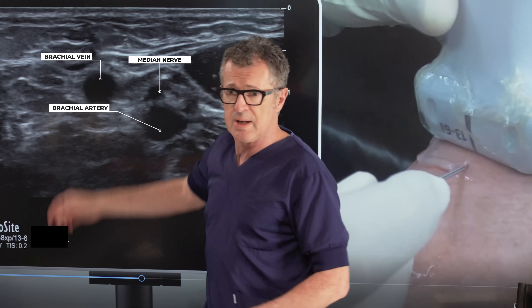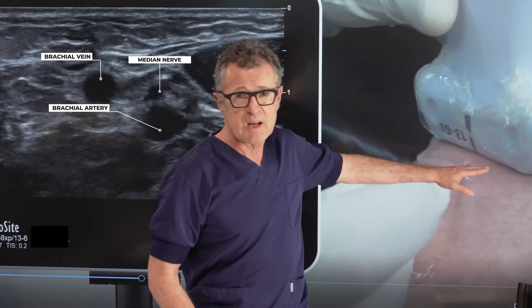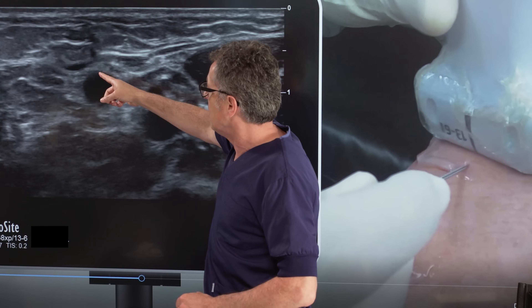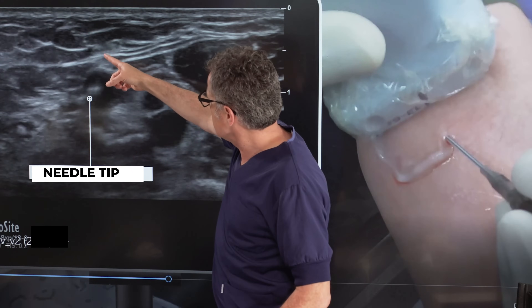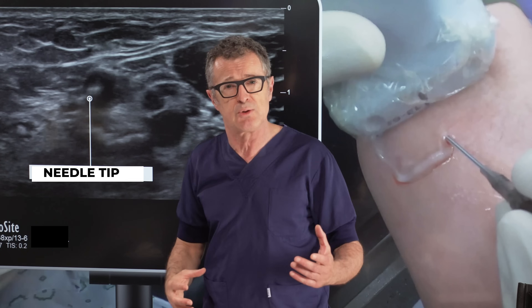What we want to do is, as we insert the needle towards the ultrasound probe, at some point we would like to see the needle tip above the wall of the brachial vein. We can see we're inserting the needle out of plane, but we can see what it does to the tissues.